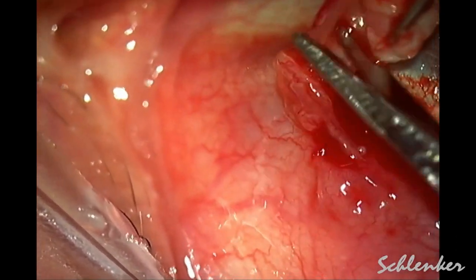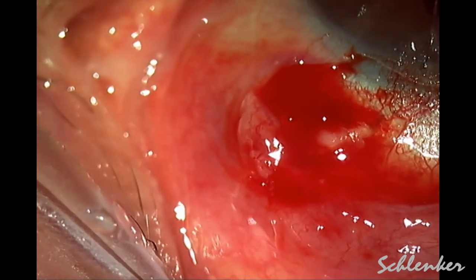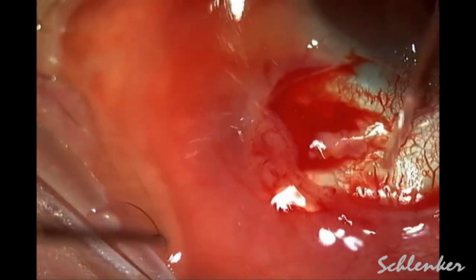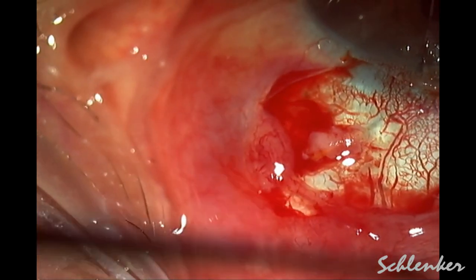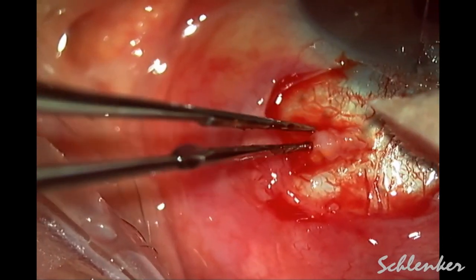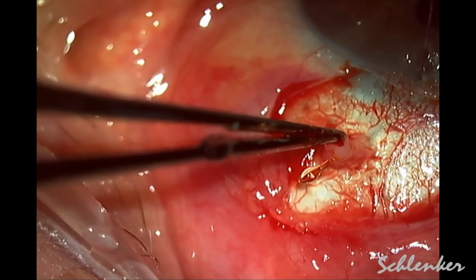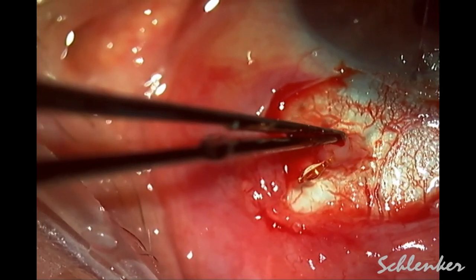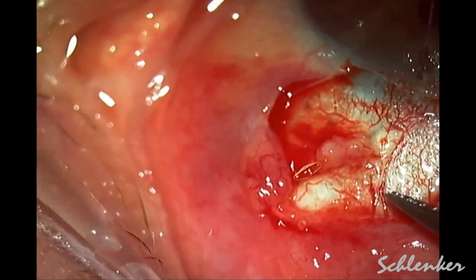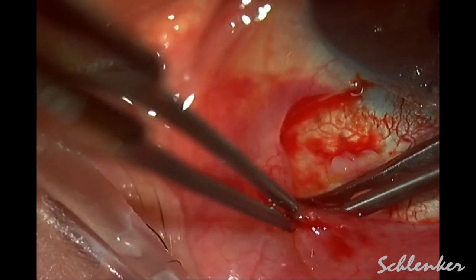So we decided to do a tenonectomy here. I also would have reconsidered if the conjunctival closure was going to be difficult, but despite having that buttonhole we were still reasonably confident we could achieve a good pull-down. Another advantage of the Xen or PreserFlo micro shunt bleb is that it is usually more posterior, making the closure a bit more forgiving than a trabeculectomy, which can establish quite limbal flow.